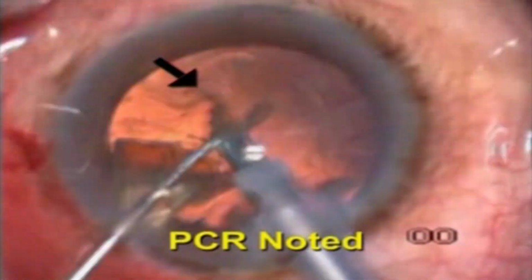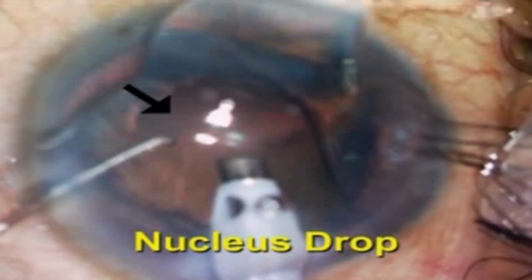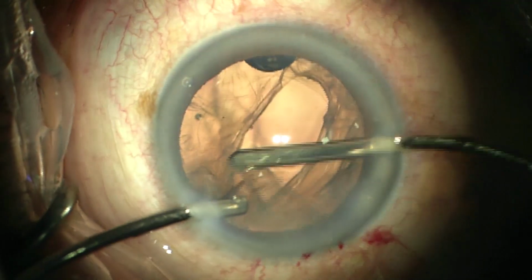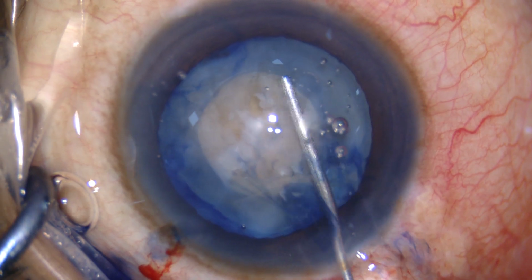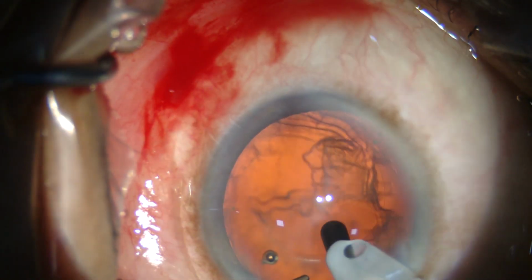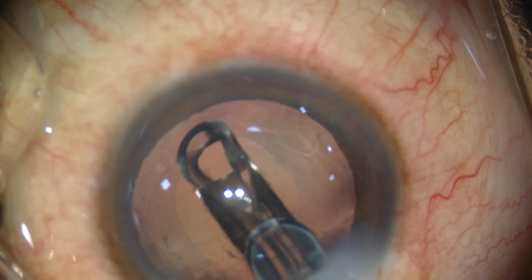Early recognition combined with advances in instrumentation have enabled effective management of posterior capsule rupture and vitreous loss during phacoemulsification. Posterior capsule rupture can occur at any stage of phacoemulsification, for example, during hydrodissection, nucleus removal, cortex removal, posterior capsule vacuuming, and during IOL implantation as well.